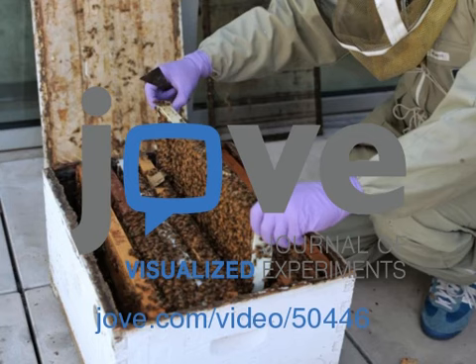Insert the needle into a side of the abdomen to avoid damaging internal organs. Press the syringe plunger slowly to allow the double-stranded RNA to be absorbed. Since double-stranded RNA is very viscous, it takes 2 to 3 seconds to completely expel it from the syringe. After completely pushing down the plunger, leave the needle in the wound for 4 to 5 seconds.